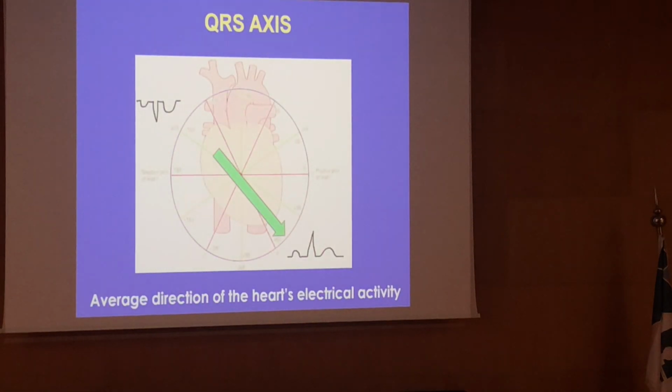And we'll show examples. Now, when you come to the QRS complex axis, or cardiac axis, what does it mean? What's the meaning of axis? Axis is the average direction of wave of depolarization. So remember, the heart is like this. Activity goes from up, down. It's spread actually in three-dimensional, so it goes everywhere. But what is the main vector of activation?